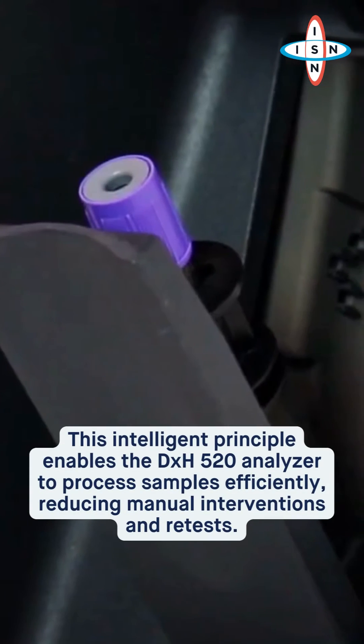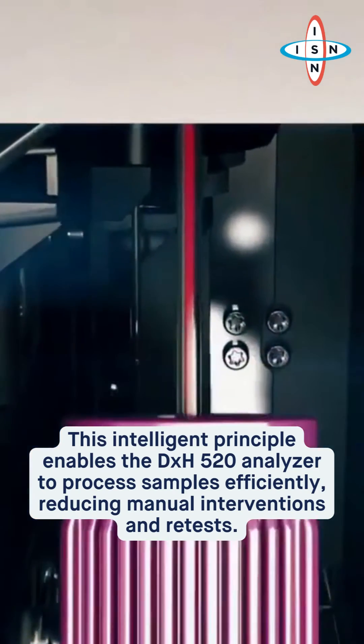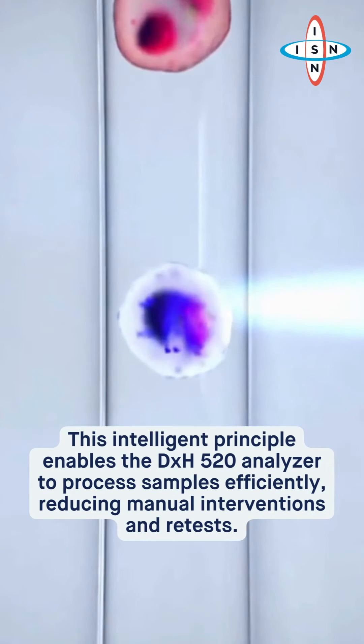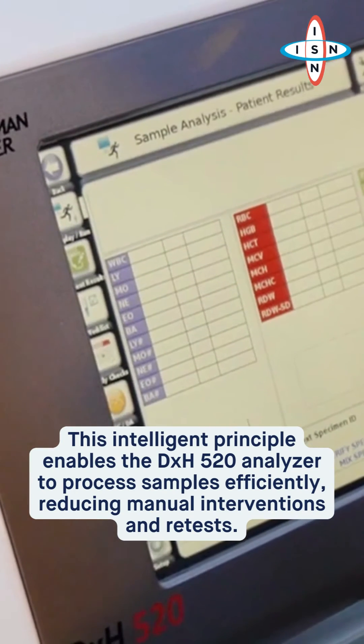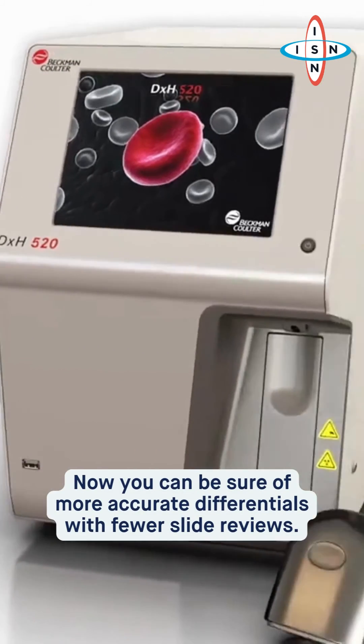This intelligent principle enables the DXH-520 analyzer to process samples efficiently, reducing manual interventions and retests. Now you can be sure of more accurate differential results with fewer slide reviews.